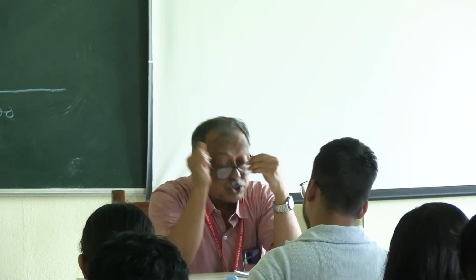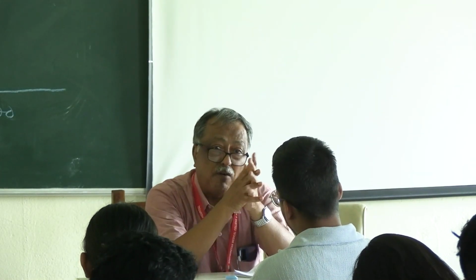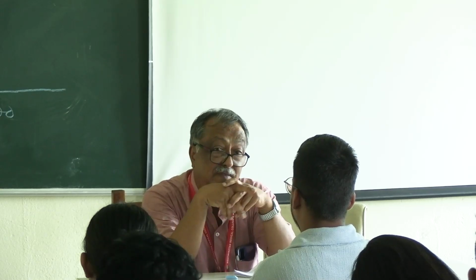Now, loudness discomfort level. Loudness discomfort level is required for giving a hearing aid.